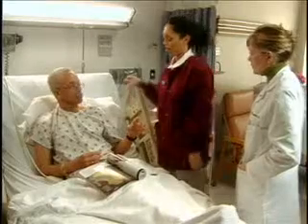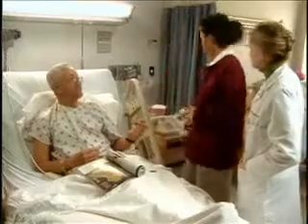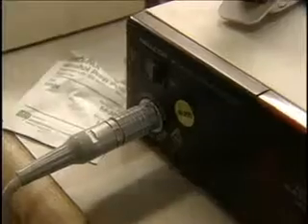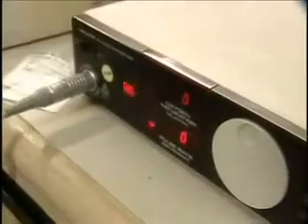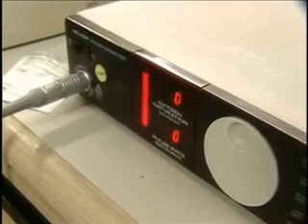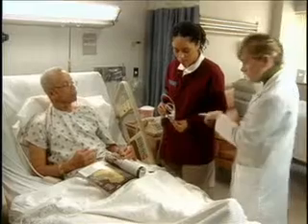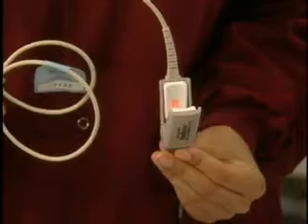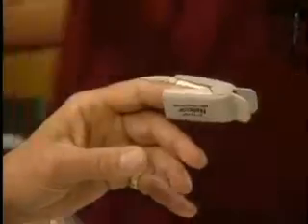And you don't happen to have artificial nails? Jeez, no. Okay, so now I'm going to double check the connection of the sensor probe with the pulse oximeter and, of course, the equipment. Machines will have a bar or a waveform indicating signal strength and or an audible beep. The probe has two sensors, a light emitting sensor and a light receiving sensor, and they have to be properly aligned in order to get an accurate reading. Okay, so now we're just going to place the probe securely onto the skin.